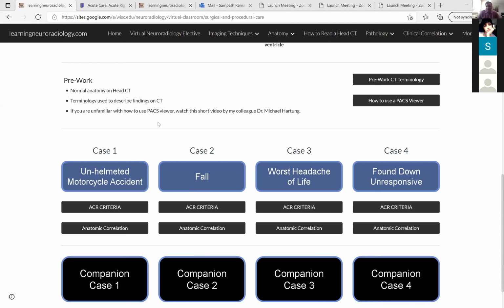As far as the gist goes, I chiefly look for something that can kill the patient right away. Those are the things you should look at in an acute setting. You want to make sure that the patient is not going to die quickly, like those cases I showed you with the epidural and subdural hemorrhages. Those things have to be surgical. You have to take care of the patient right away.